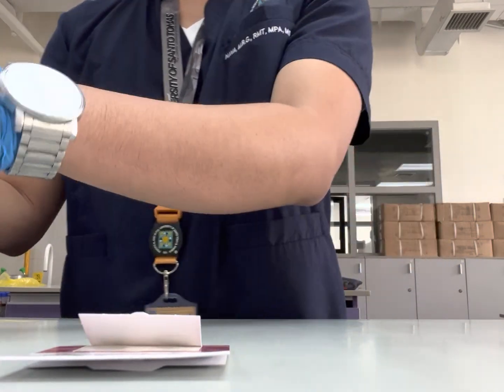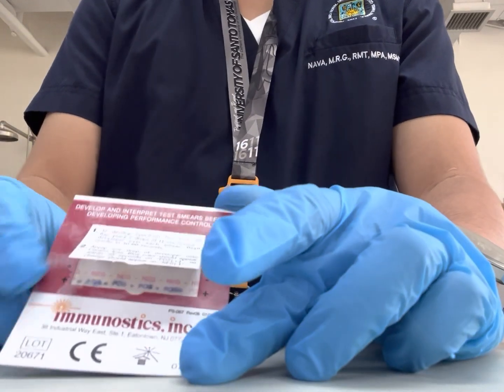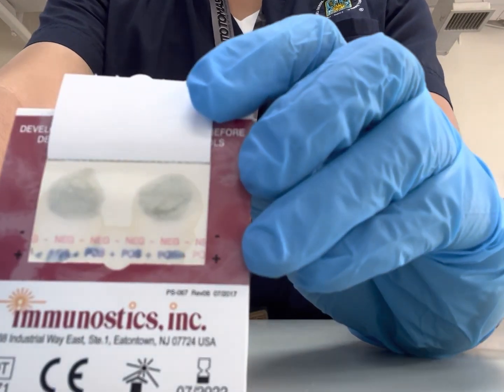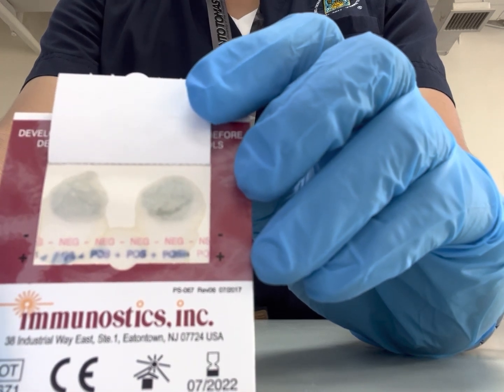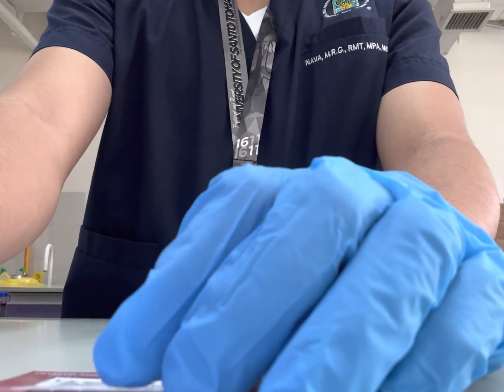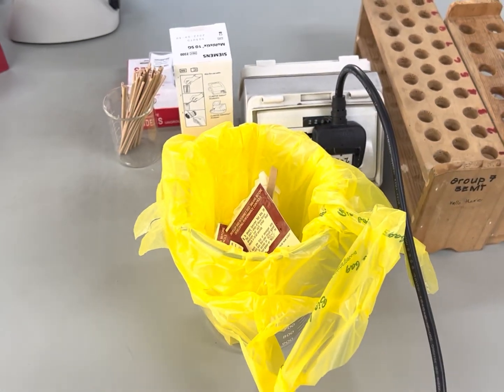The results can be read immediately after 30 seconds. The positive reaction is indicated by any tinge of blue on the smear area. In the control area, the negative line must remain colorless and the positive line must turn blue to indicate the validity of the test.